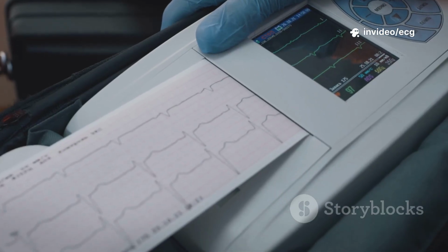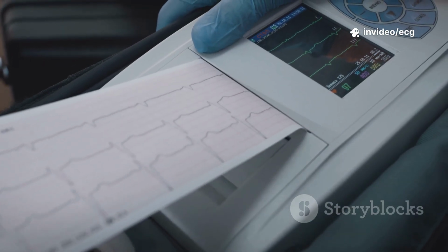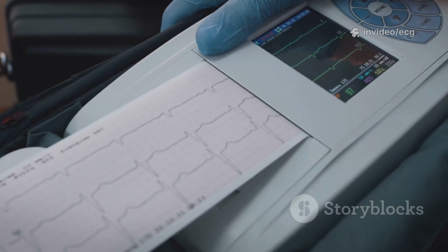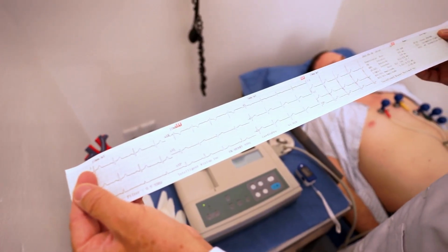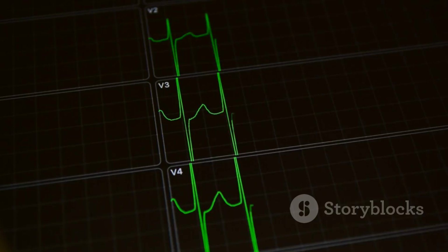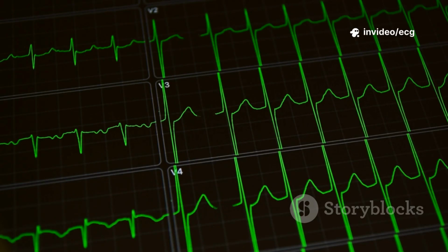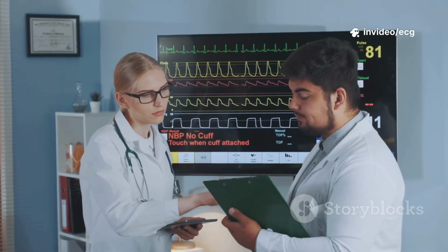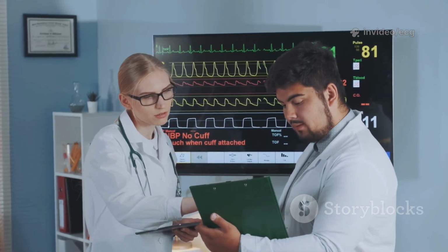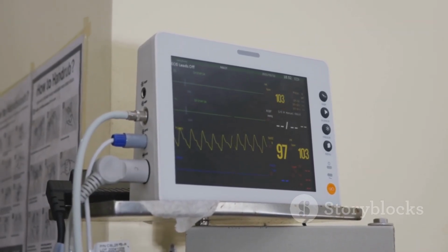An ECG is simply a recording of the heart's electrical activity as detected by electrodes placed on the surface of the skin. Think of it as listening to the heart's electrical symphony from different seats in a concert hall. Each electrode, or lead, provides a unique perspective. A standard 12-lead ECG gives us 12 different views, allowing for a comprehensive assessment of the cardiac conduction system.